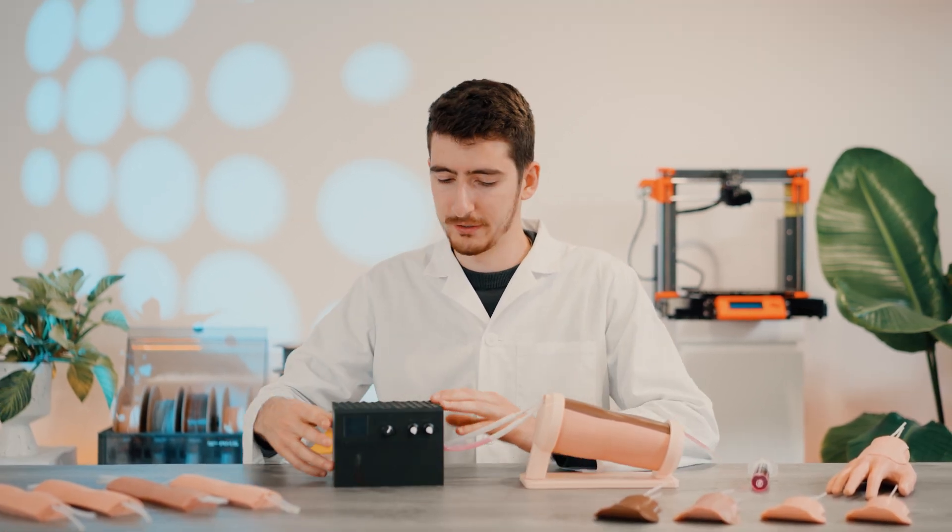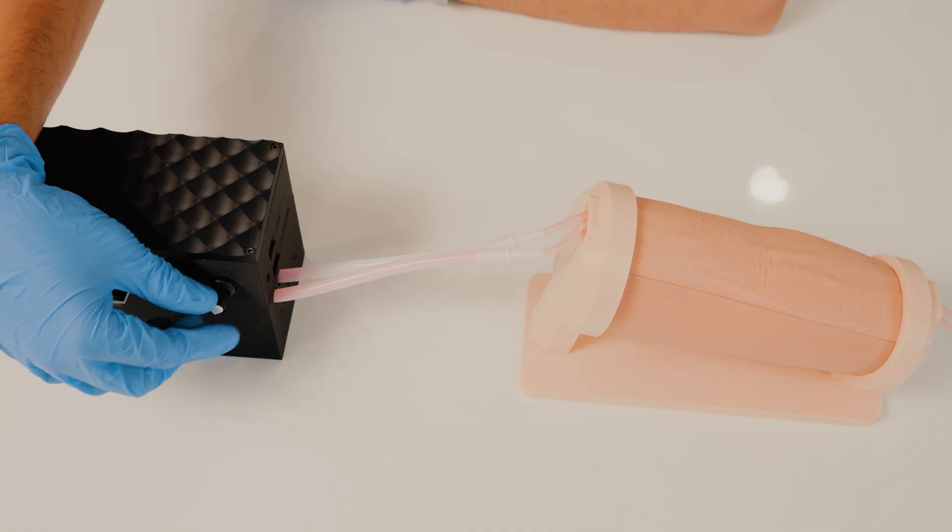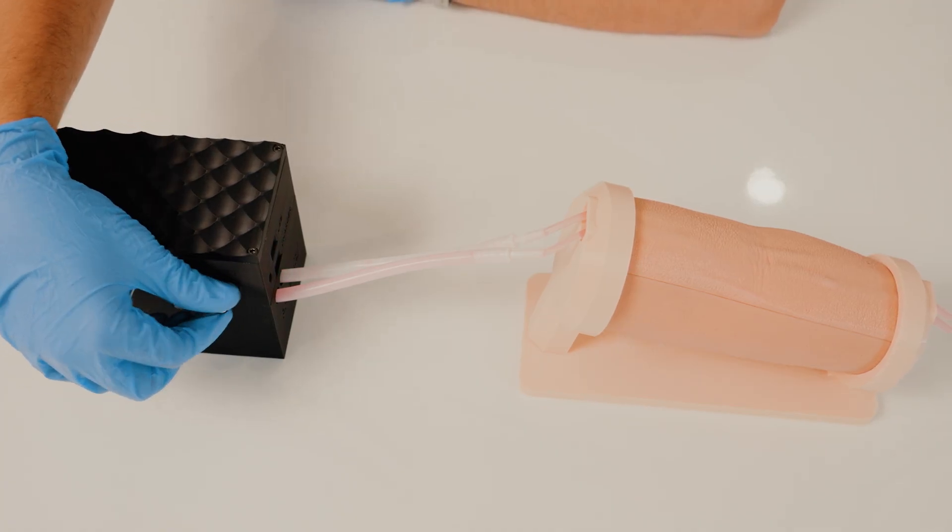It is really easy to use. Simply turn it on, and the blood will start pumping through right away. You can easily set the blood pressure and pulse rate to your desired amounts.